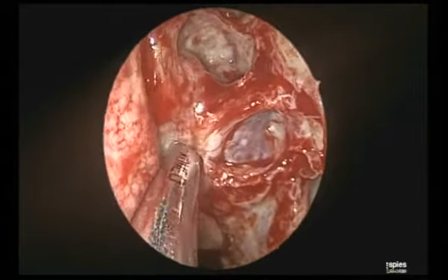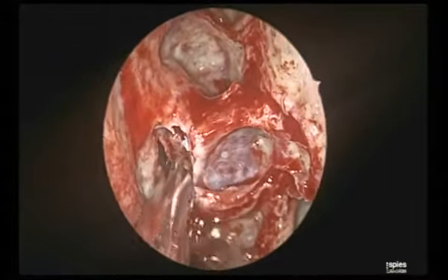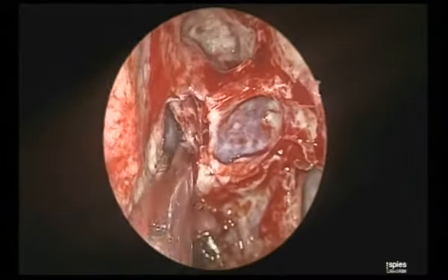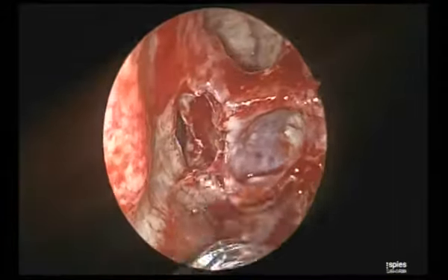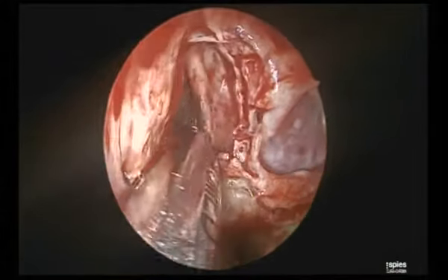See now, I entered into the ground lamella. Now what you see behind is the posterior ethmoidal cell. I told you, I am scared to do posterior ethmoidectomy unless I know where is my posterior limit. So see now, what I told you during CT scan, the moment posterior ethmoid starts, it is bounded medially by the superior turbinate. Can you see?